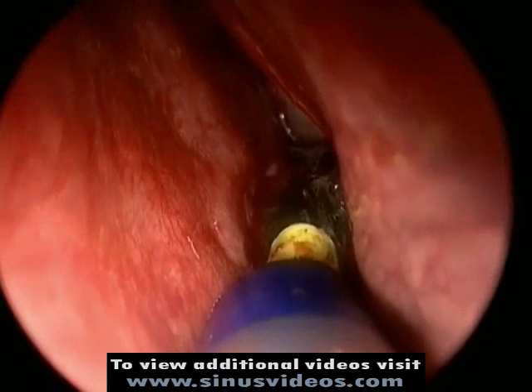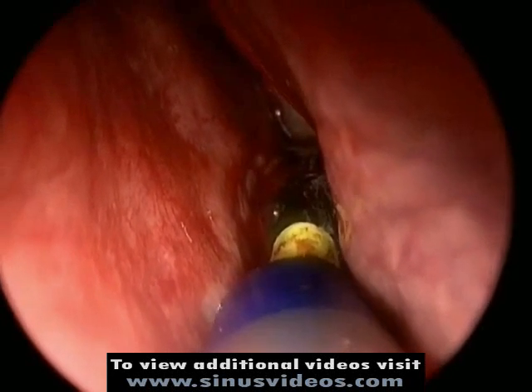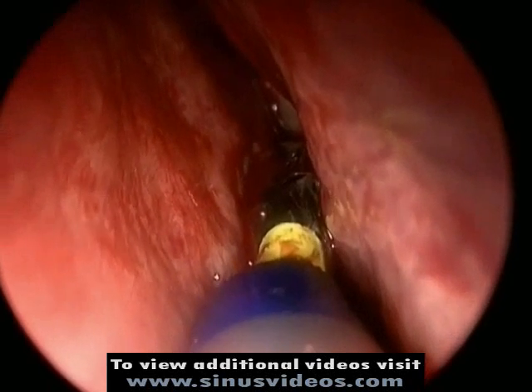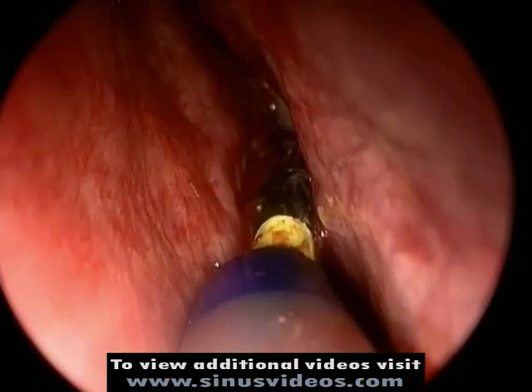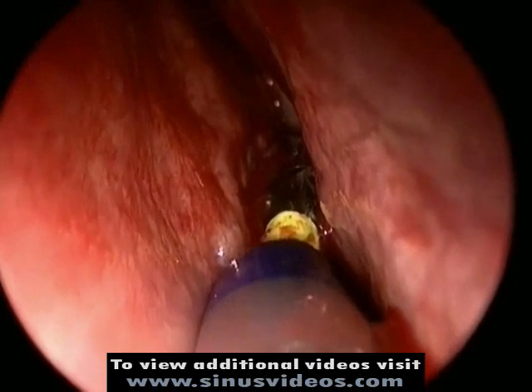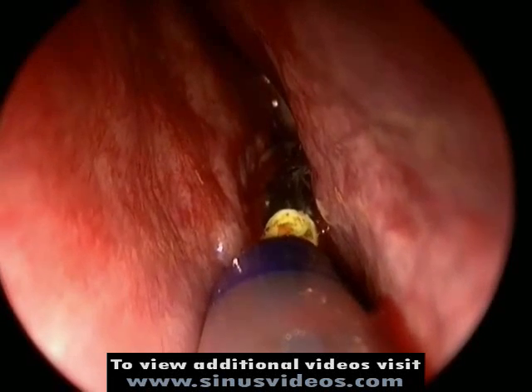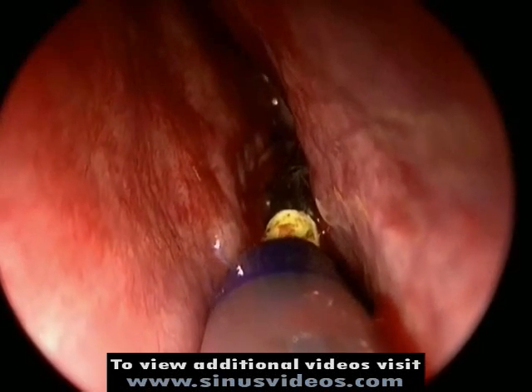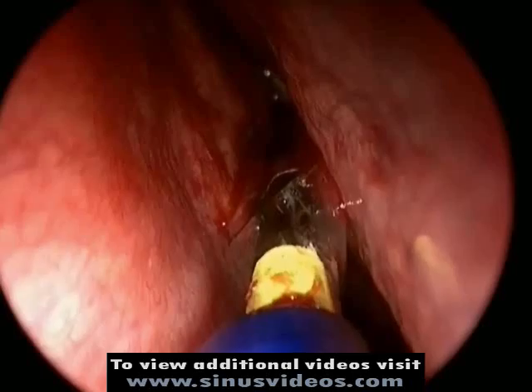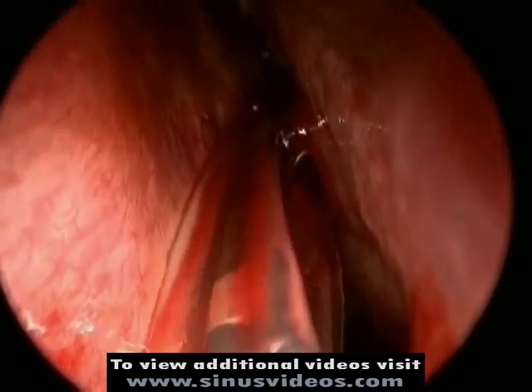The balloon is inflated with saline. In this case the balloon measures 5 mm in diameter and 16 mm in length. It is inflated to 8 atmospheres of pressure and then deflated.